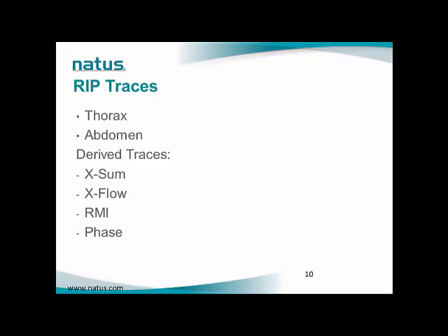xsum, xflow, that represents the time derivative of the sum of the thoracoabdominal effort that can be used as an alternative to the nasal pressure and thermal signals. RMI and phase will be discussed in the following slides.